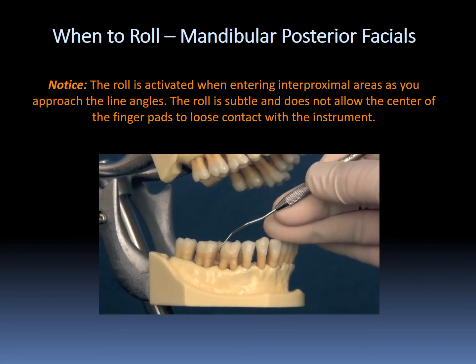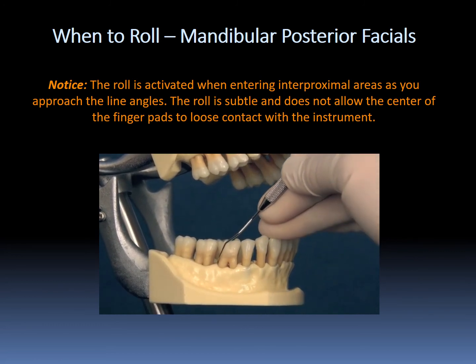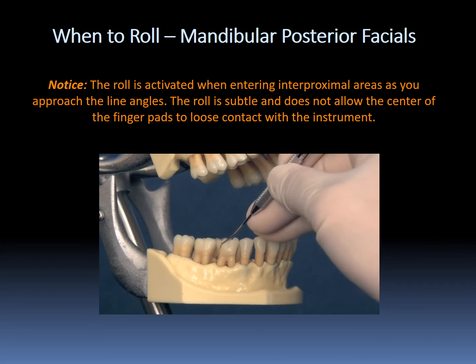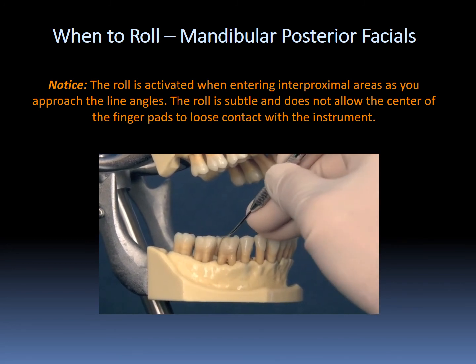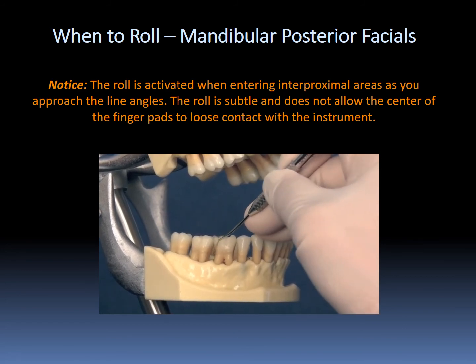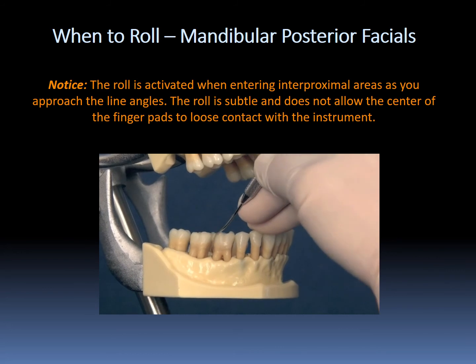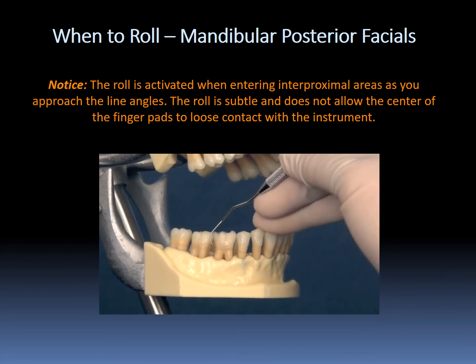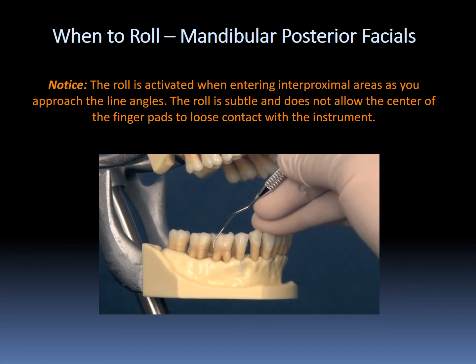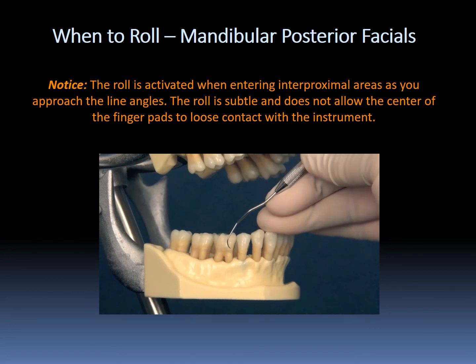We take it out and then adapt at the distal line angle. Gently insert this subgingivally, and when you get to the base of the pocket on a real patient, it'll feel like a taut rubber band. We're going to adapt, and then again doing a slight motion, moving on the fulcrum. We're going to do vertical strokes across the distal. Sometimes you do straight vertical strokes, and sometimes you'll be doing oblique strokes, but remember to keep the first millimeter or two of the tip of the Explorer against the tooth. So continue practicing across the buccal and on the mesial and the distal with the 1112 Explorer.